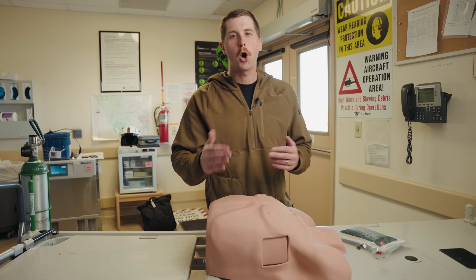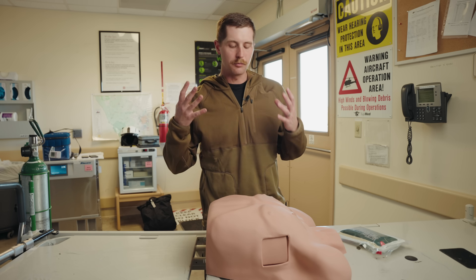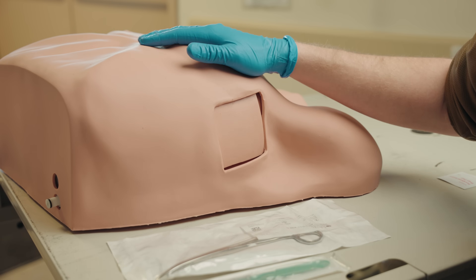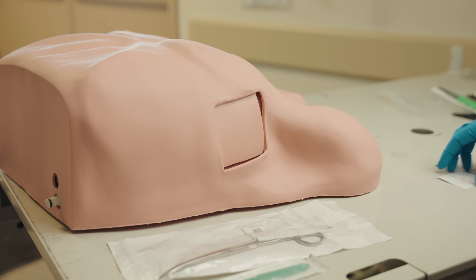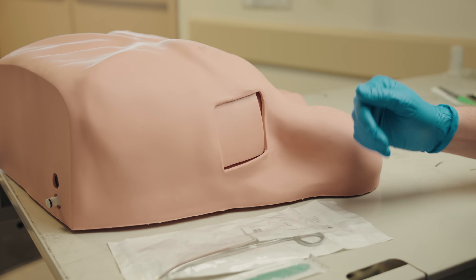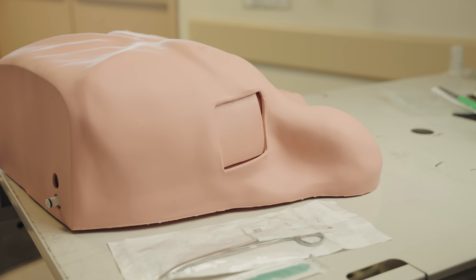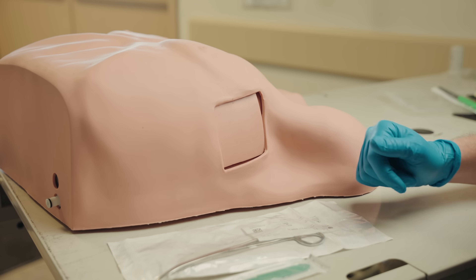I'm going to demonstrate this procedure and talk through it as I go, then show it again in real time to drive home the simplicity. I have my PPE on — obviously no face mask since this is a fake patient. We have my size 10 scalpel, my curved Kelly's, and a prep pad to clean the site before cutting. The reality is in the pre-hospital environment that none of this is a sterile technique, but if you have the time to drape and make it sterile, do it. Usually in the pre-hospital environment, we're just going to do our best to be aseptic.